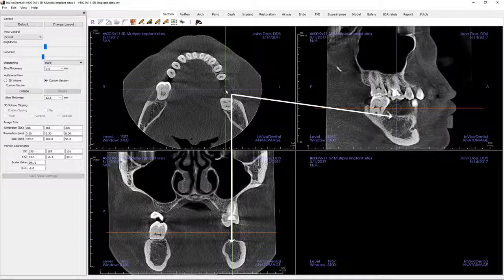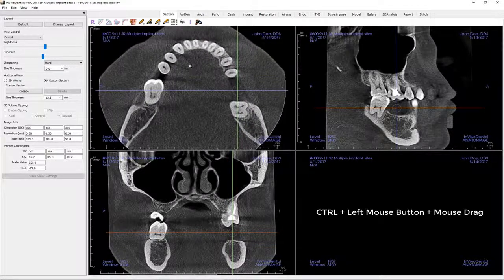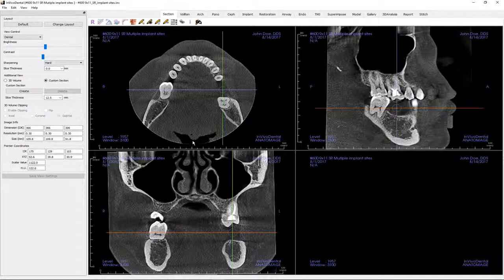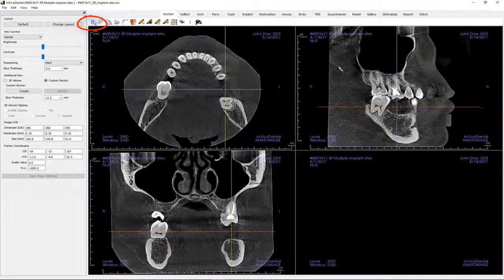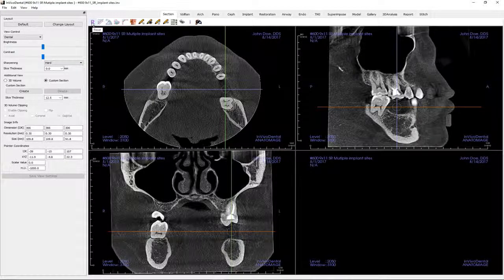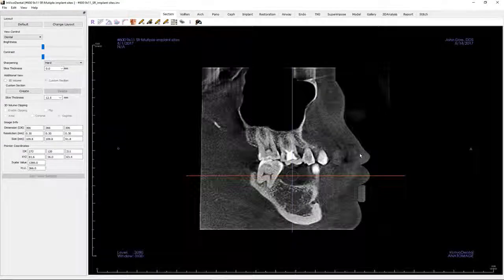Two corresponding orthogonal views of the selected region will automatically appear in the associated view windows. You may find that you need to zoom in on an image for greater visibility. This can be done in two ways. First, move the mouse cursor to the desired image, press the Control keyboard key and the left mouse button, and move your mouse upwards to zoom in or toward the bottom to zoom out. To quickly revert to the default view, click the Reset View icon on the toolbar. The second way is to double mouse click on the image. To return to the original view, double mouse click on the image again.